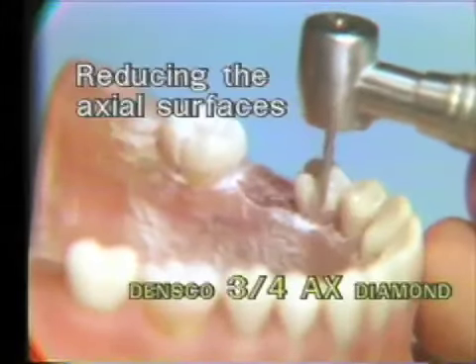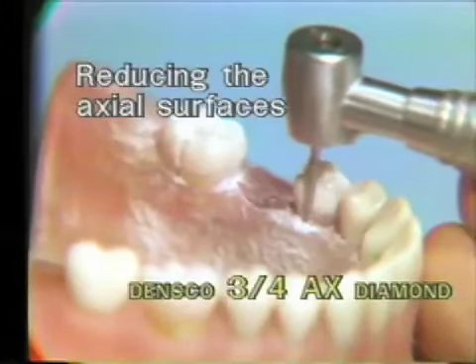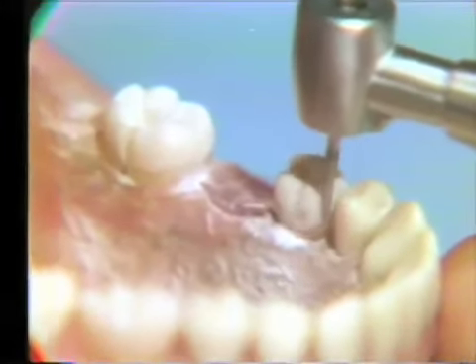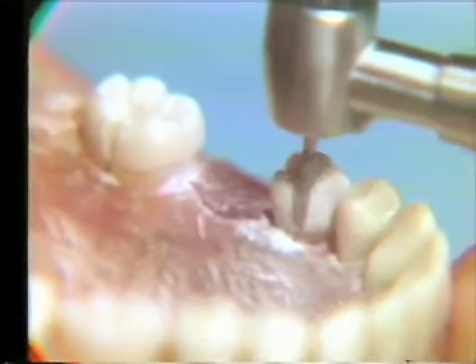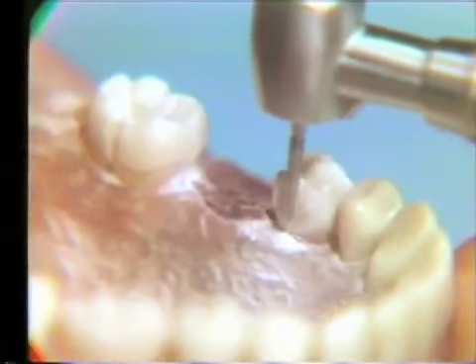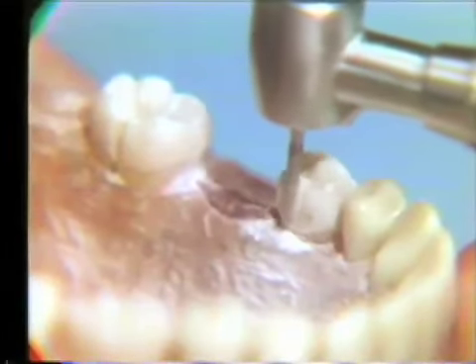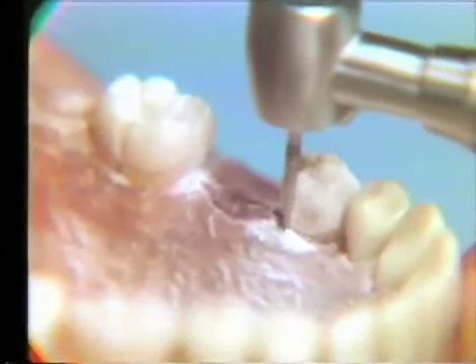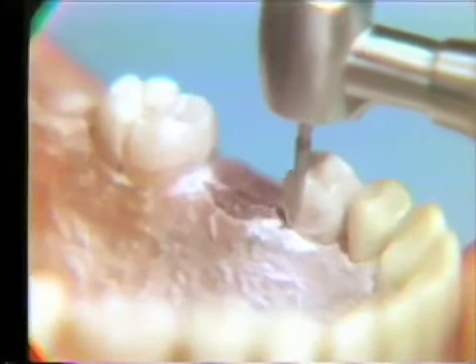The same instrument is used to reduce the axial surfaces. Here we are starting on the lingual surface, blending into the mesial slice previously established with the one-eighth diamond. This peripheral, or axial, reduction is carried out to the depth of the tracer cuts, which is one-half the diameter of this three-quarter AX instrument. When the lingual surface has been reduced sufficiently on the bicuspid, then the peripheral or proximal surfaces of the molar will be reduced.